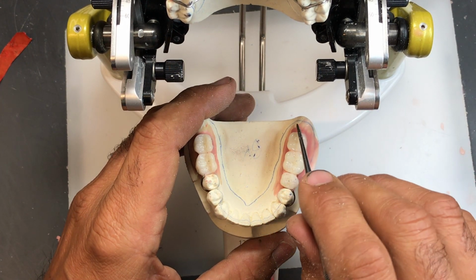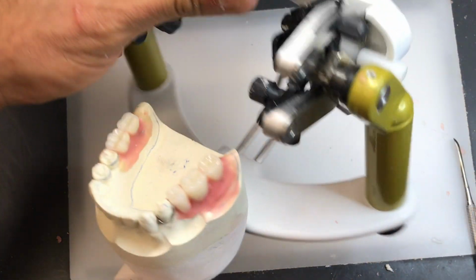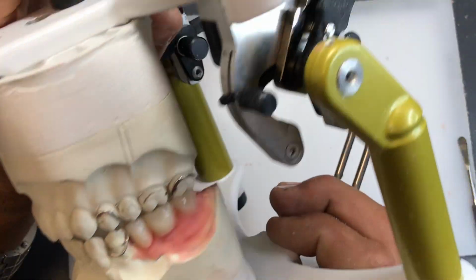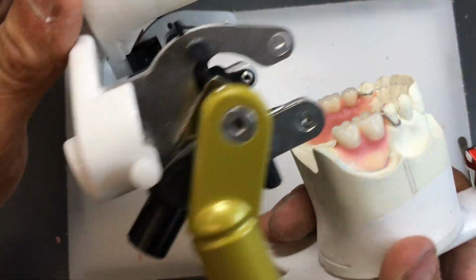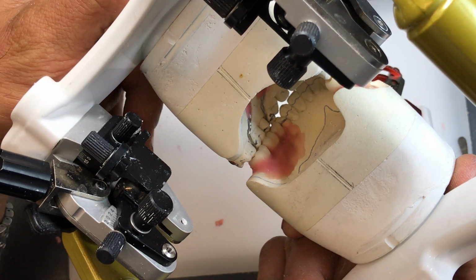So now I have a better alignment of my central fossas and the marginal ridges, I think. And hopefully I didn't move things around too much. Looks okay. Pin is open, but let's just see how it looks on the inside. That looks like it's lining up okay.